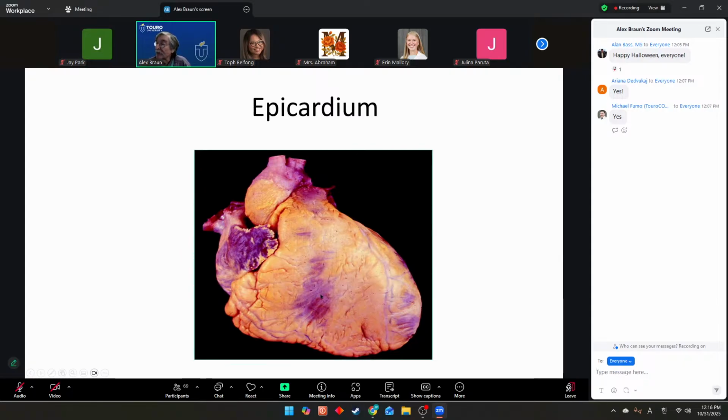Now, not all of the epicardium has adipose tissue. There are areas without much fat at all. For example, where I'm putting my pointer right now, there's not much fat, and over here there's some areas where there's not much fat. So depending where you took a section, you may or may not see fat, but most of the time it's quite easy to see fat, which has a cushioning influence on the surface of the heart. If you've got a blow to the chest, for example, the fat would cushion the heart and protect, by the way, the blood vessels, which are circumferentially traveling over the surface of the heart, the coronary vasculature, the coronary arteries, and also the veins of the heart.